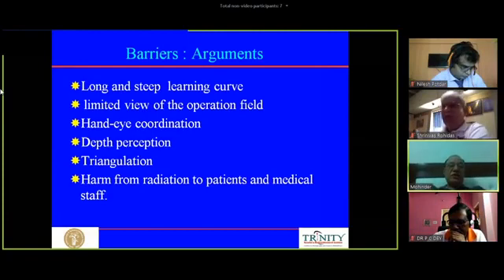In fact, triangulation is nowadays more important in spine when a surgeon is trying to learn UBE, unilateral biportal endoscopy, which is popularized by Dr. Sohn. So we have inbuilt triangulation in endospine. There's no chance of instruments going astray. Your instrument is in any case going to go in front of the scope and you will not have that problem.